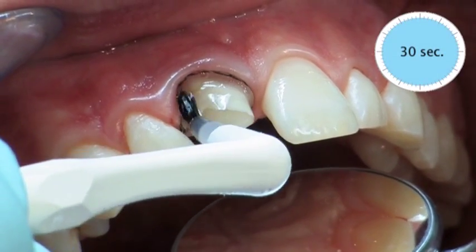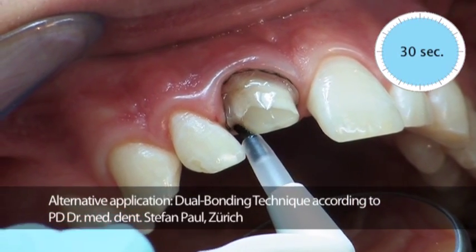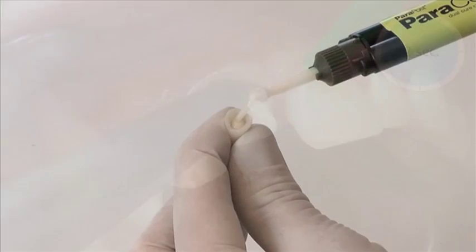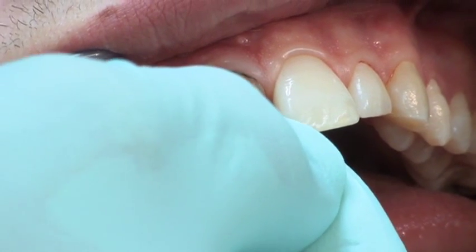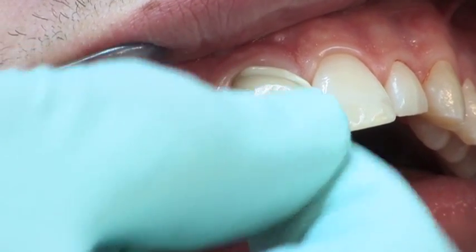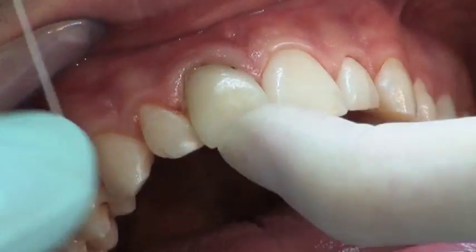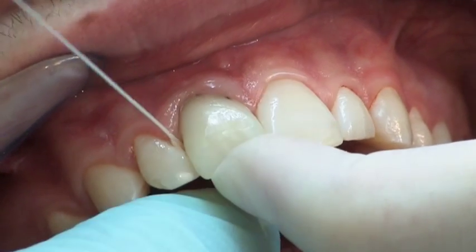Reapplication of Parabond adhesive shortly before the final cementation significantly increases the retention of the ParaCore cement. The application of ParaCore for the cementation of posts, restorations and core build-ups guarantees an optimal monoblock bond interface between the post, cement, dentin and crown, resulting in one cohesive restoration with outstanding durability and strength. The restoration is held into place with increased pressure and the excess cement is removed afterwards.